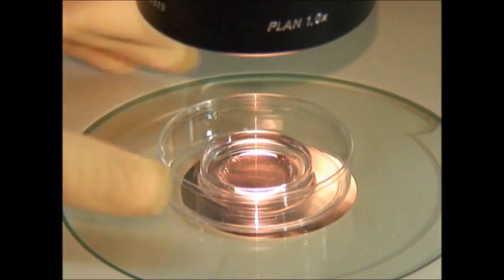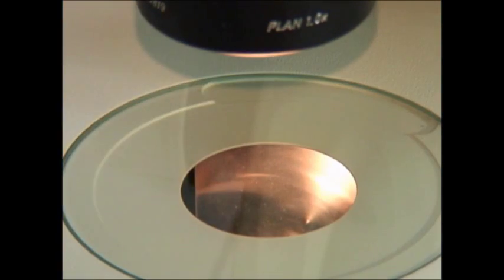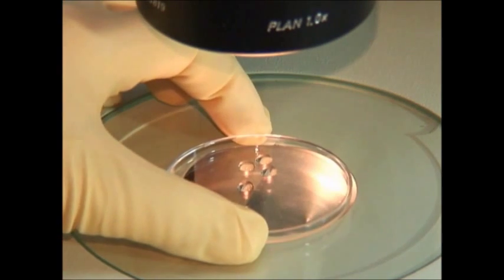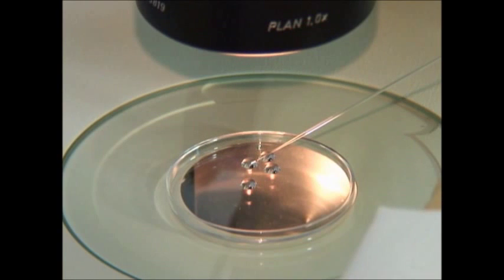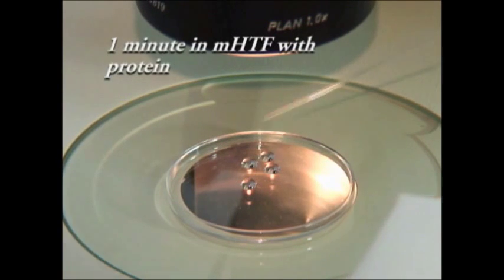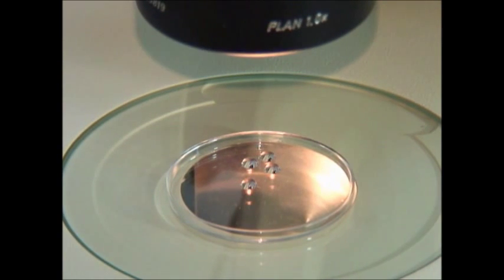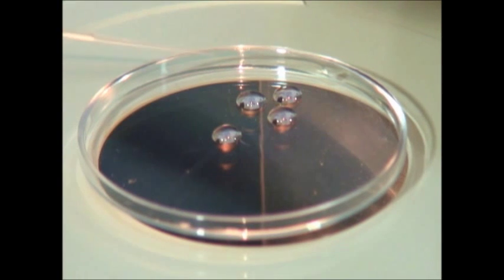Prior to starting the procedure, the cryotips should be inspected under the microscope to rule out any defects. Next, four 20 microliter media drops are made in a sterile dish - one drop with modified human tubal fluid or HTF and the remaining three drops with the equilibration solution.